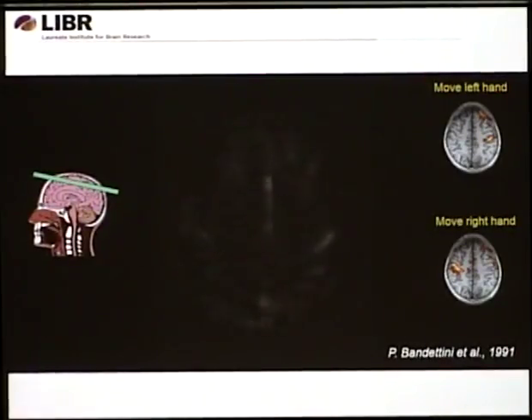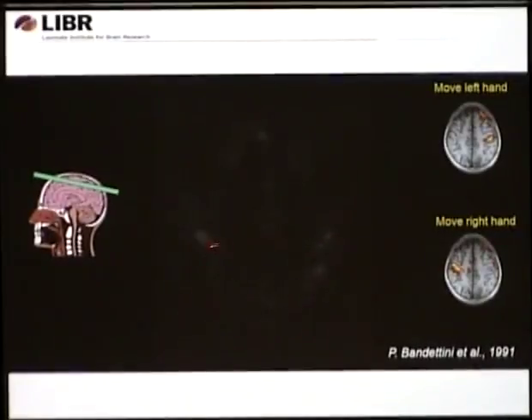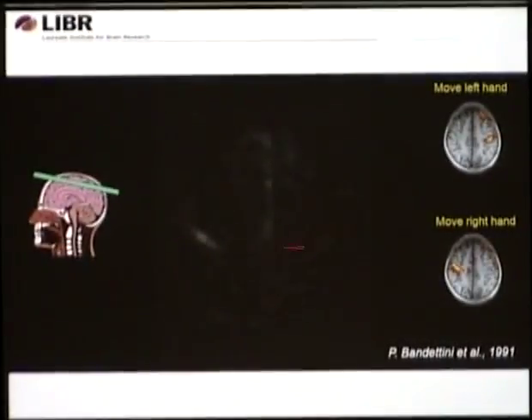And then the subject was asked during this experiment to move fingers like this on one hand, and then on another hand, and then toggle, on, off. So left on this image is right there. So you see suddenly in the motor area cortex that the MR signal goes a little bit up, so it's a little bit brighter. That means the subject is actually tapping those fingers on the left hand, then stops, and then the right hand, and so on.